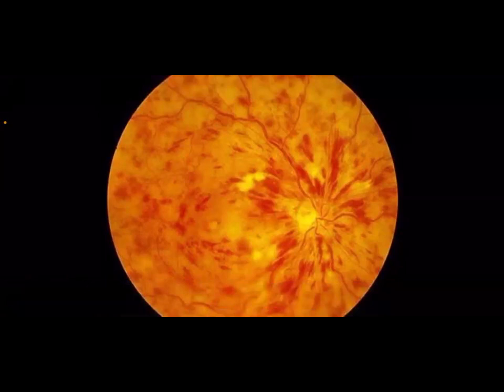But also, don't try to mention the small, tiny details. Don't mention to the examiner that this patient has got blots and dots hemorrhage, and he has got flame hemorrhage in the upper lateral retina, and he has got neovascular formation in the medial side of the optic disc. No, don't do this. Because even the examiner himself is not expert in ophthalmoscopic examination, okay?